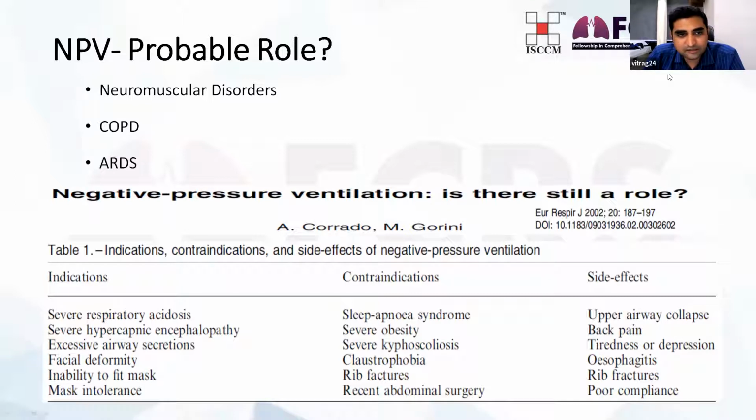So all these pros are there with negative pressure ventilation. In chronic neuromuscular disorders with chronic respiratory failure and COPD, there is some role; in ARDS, plus or minus. There are some case reports and some papers showing benefit, but widespread use is not there in ARDS either. There are very few cases and case series.